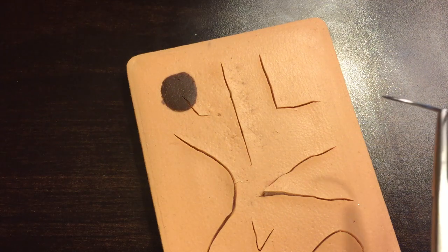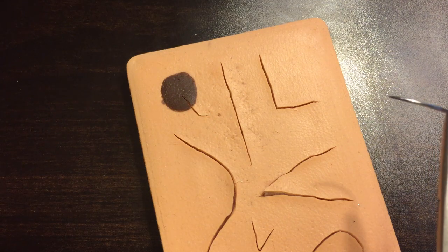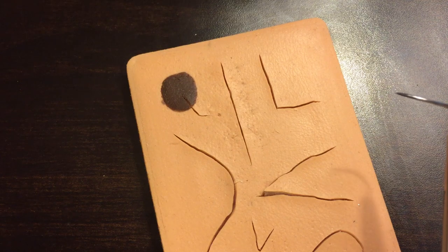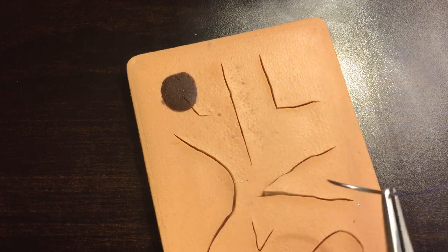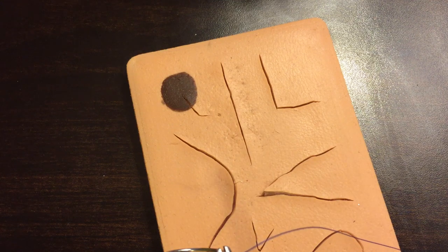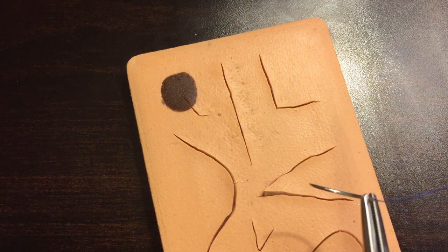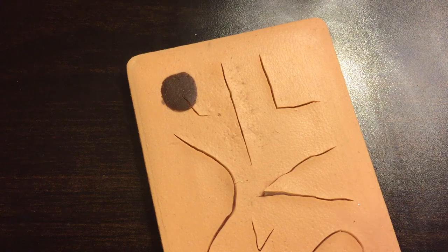Hey everyone, I'm going to demonstrate for you a running locking suture. It's different than a simple interrupted suture in that it's a continuous suture. You only cut it at the ends rather than cutting it with each knot because there are only two knots with this technique. So let me show you.